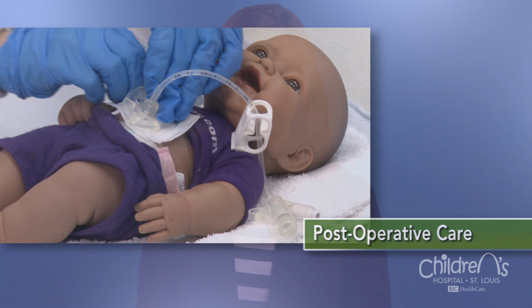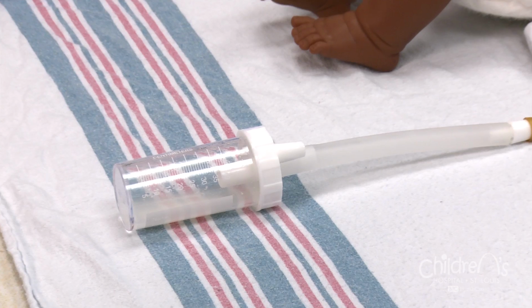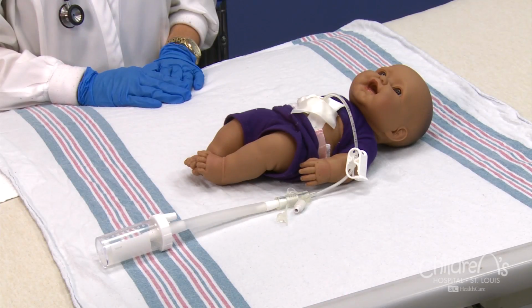Following surgery to insert the G-tube, your child will need rest, pain management, IV fluids, and sometimes IV antibiotics. Your child will come out of the operation and may still be a little sleepy from anesthesia. This is normal. For the first 24 hours after surgery, your child's gastrostomy appliance may be connected to a small plastic container. This allows any stomach contents to drain out.